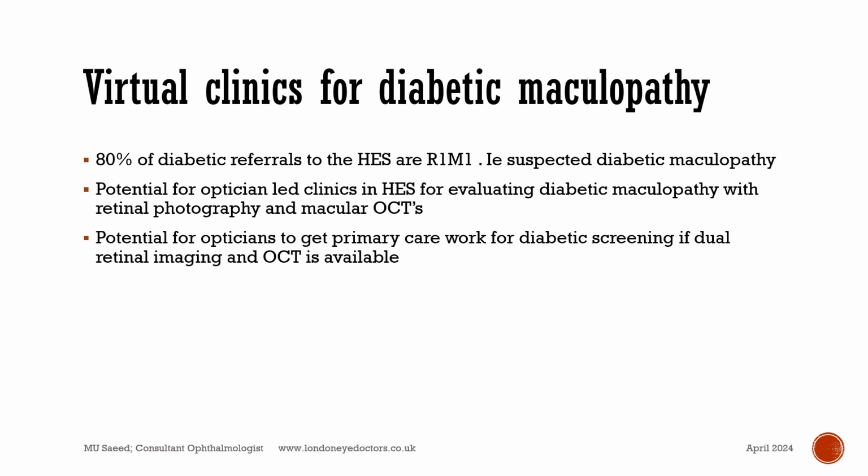The doctor will then subsequently view the images, including the Optos scans, as well as the OCT images, and then write to the patient. This type of clinic is particularly liked by the patients because they can see what's happened and they can get in and out of the clinic very quickly.